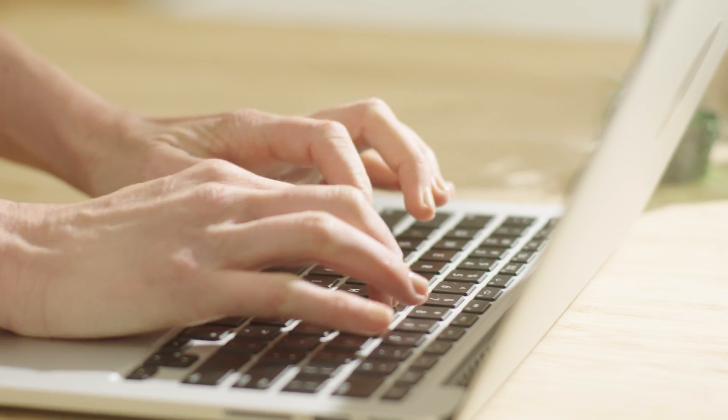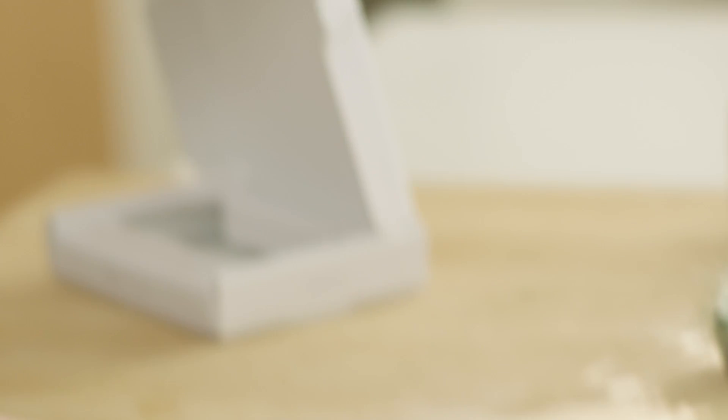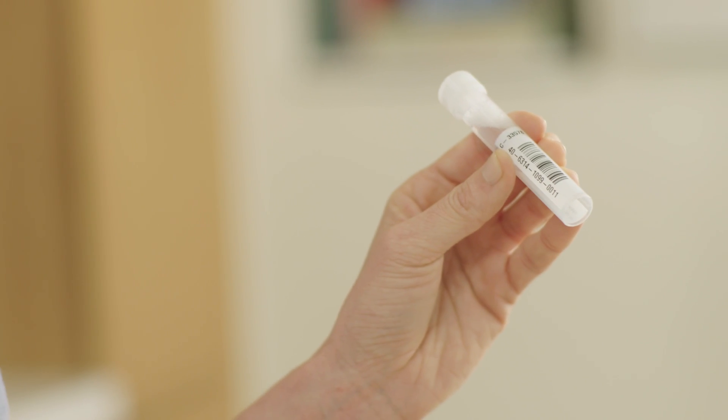Visit www.getcolor.com to link your sample to your Color account. You will need the barcode found on your saliva tube. It is absolutely necessary that you activate your kit, or we will not be able to analyze your sample.